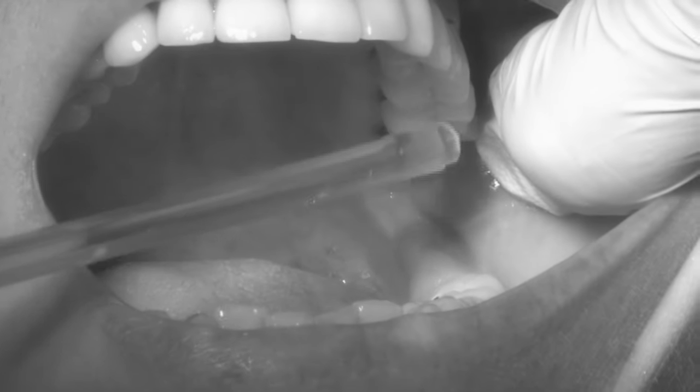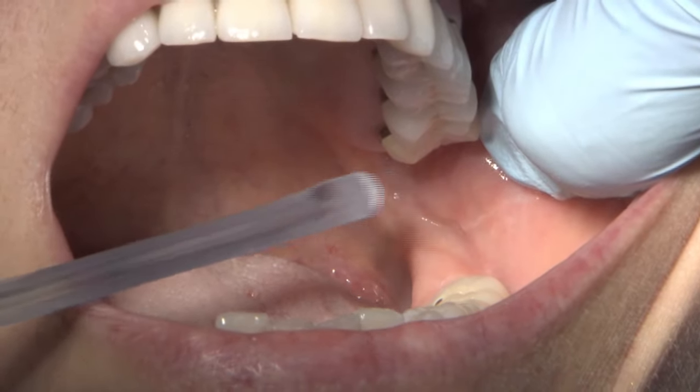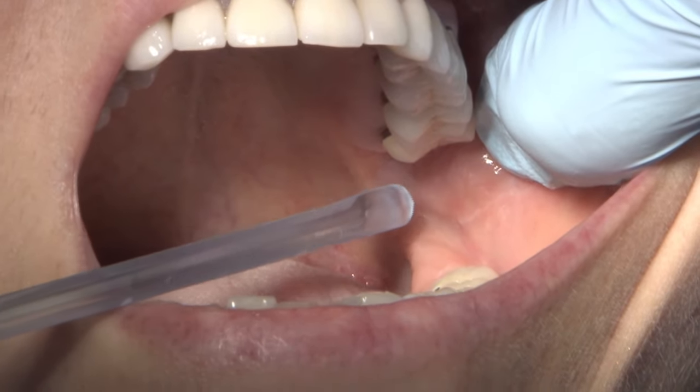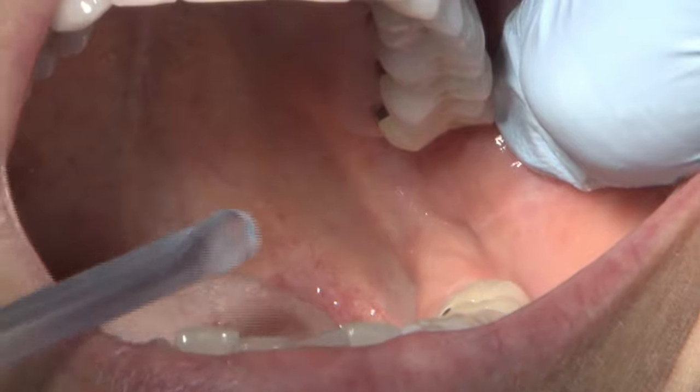When I come in, I want to choose the height of my penetration with respect to the mesolingual cusp of the molar, and I'm going to be distal to the second molar. I'm still coming in over the bicuspids.